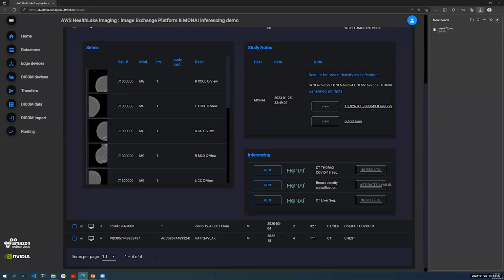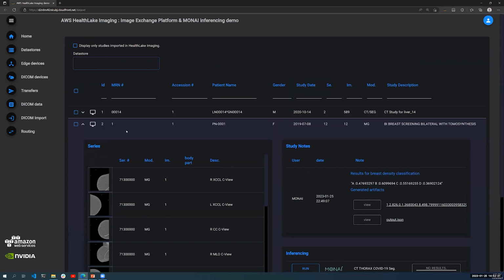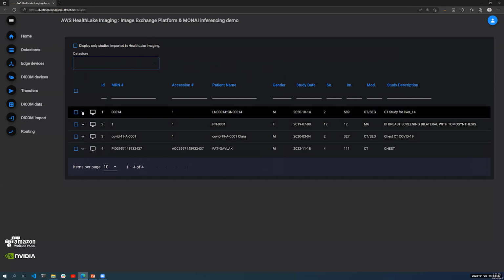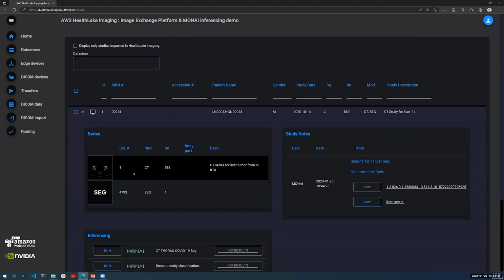That being said, if I were to use another algorithm with the same workflow, one that can produce something other than just text, I should be able to display that as well. So if I go to that study, for instance, I ran the inference for that one before the demonstration, because it takes a bit longer since the segmentation is created. I didn't want you to have to wait two or three minutes in front of a screen which does nothing.